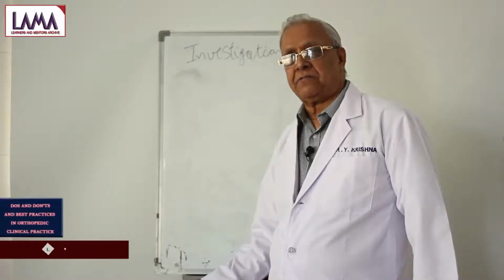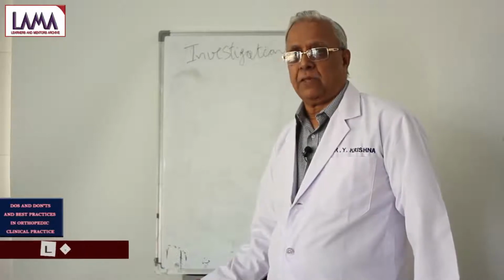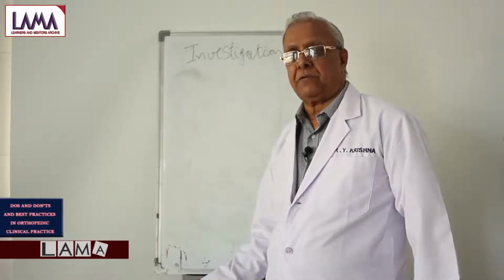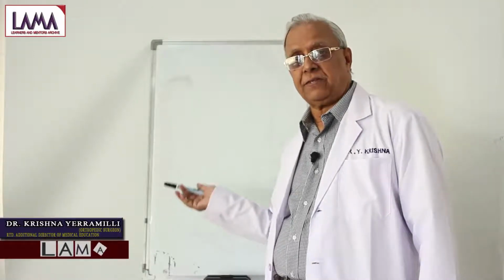In continuation of what I have been talking to you all, today I am going to brief you on things that are very important when we talk about X-rays. For example, a patient comes to an orthopedic surgeon with X-rays taken elsewhere. They might have been wrongly reported, or as I said in the beginning, the quality might have been poor. With all those things they confront us with questions like, do I have a fracture or not?